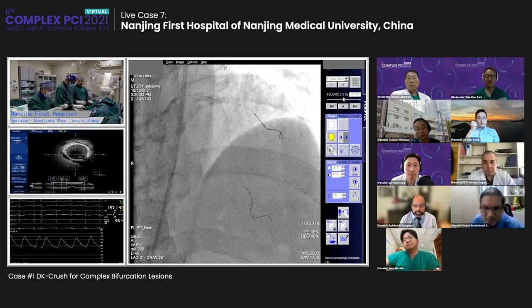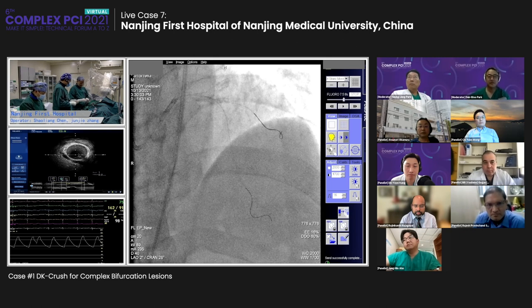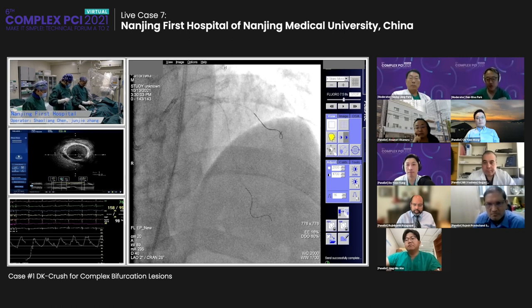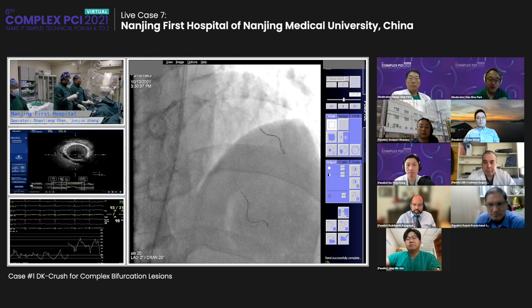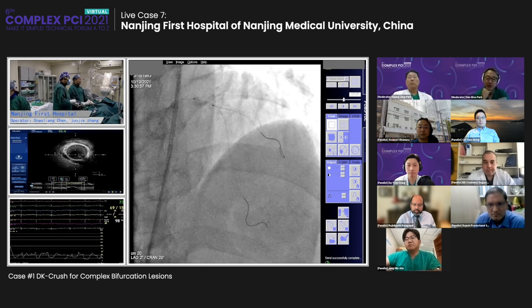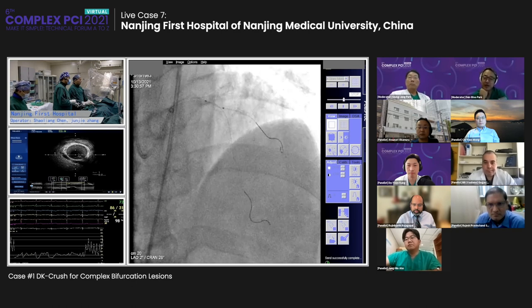Okay, great. So I think probably we need some time to prepare the lesion. So I think you can open your discussion. Okay. And Charlene, this is a typical example. Sometimes when we treat the bifurcation region, the very severely calcified region is very difficult to recross because of the large profile of the NC balloon. And Charlene, you use, it looks like, an EBU or XB guide catheter. Is that your routine? EBU is the routine use. Okay.